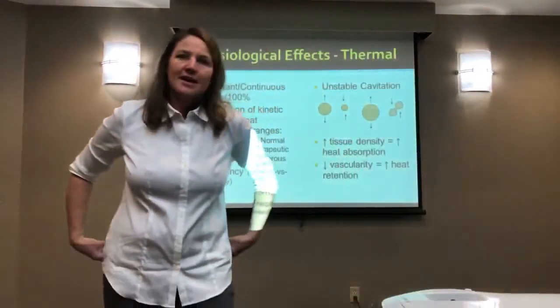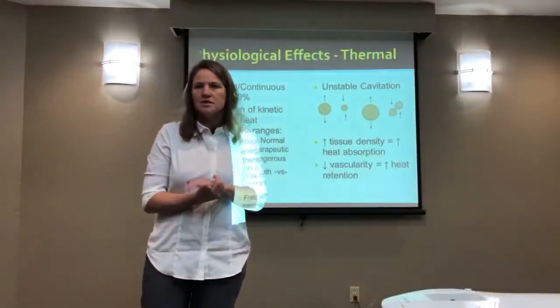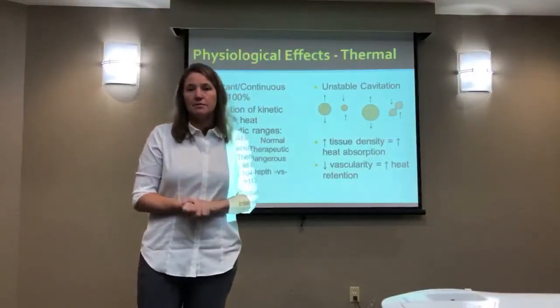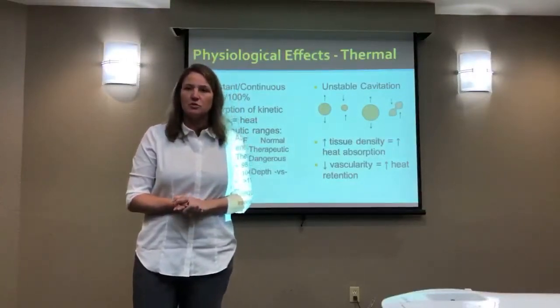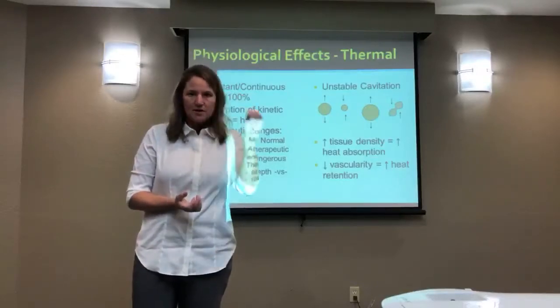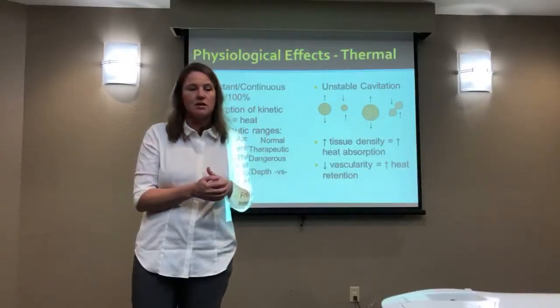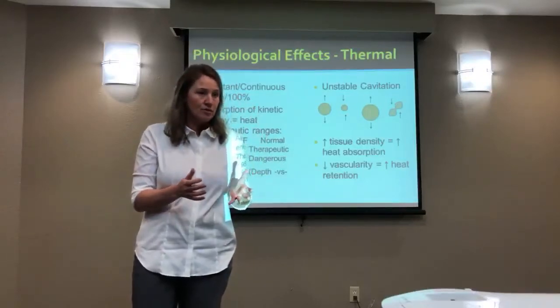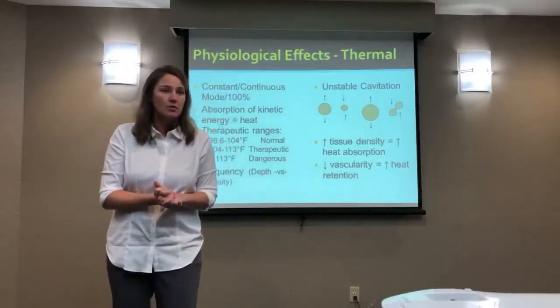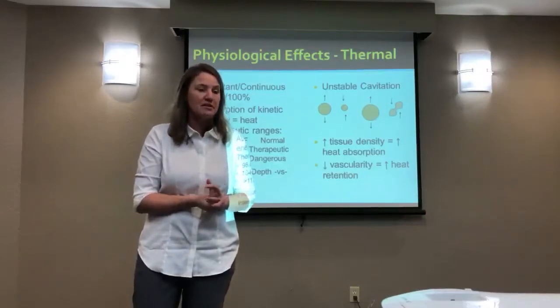It's not an exact science. All tissue is not created equal. The amount of blood flow and sensation is all variable. This is why it can be a potentially dangerous modality. We have to make sure we keep people safe because even small hot spots could potentially damage the area of tissue that you're focusing on. So patient selection is going to be important, and target tissue is going to be important, making sure you pick the right modality for the right location in order to get good effects and make sure the patient's safe.